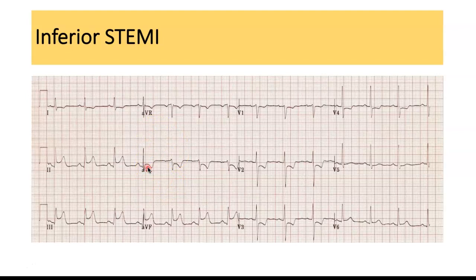If we look at the precordial leads as well, we notice there's maybe the start of some ischemia here, but for sure in lead V2, we notice some very obvious ST segment depression, and it's the downward sloping kind, which makes us think of ischemia. We can see it here in V3, and again, a horizontal pattern in V4. This would make me concerned to look for a posterior myocardial infarction. And if I suspected a posterior wall myocardial infarction, I would need to get the posterior leads, V7, V8, and V9, to confirm.